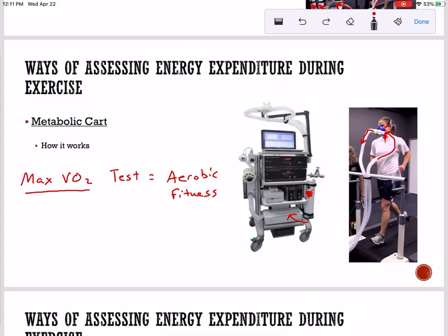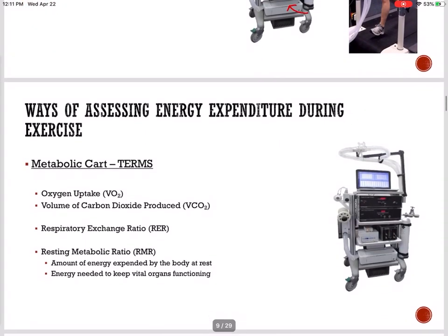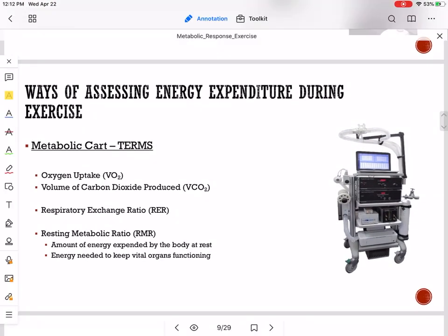The longer you can exercise, usually the more physically fit you are, but the longer you can exercise on this protocol also gives us a more accurate reading. What it's trying to assess is at your max. So ideally, the person would keep running until ultimate failure. That's difficult to do because usually our nervous system shuts us down before we reach complete failure. But the idea for this test is to estimate, at complete failure, what's the maximal volume of air you're able to bring in? Because the more physically fit you are, the more aerobically fit you are, the larger volume of air you can bring in. All right, so you may have heard of the Met cart because of the max VO2 test. We're not doing it in the lab, just wanted to touch upon it.